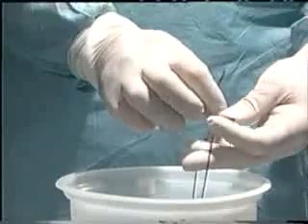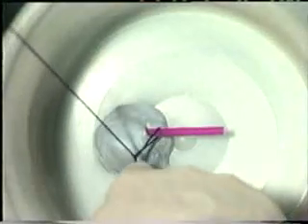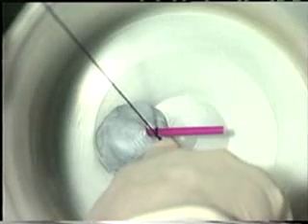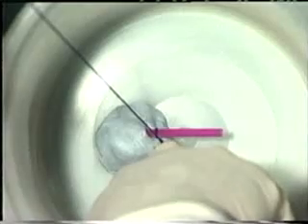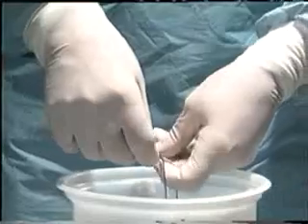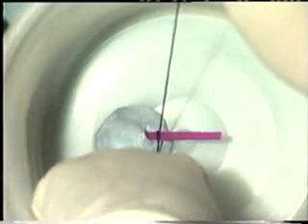Bring the suture material out of the pelvis, tie and snug that down using the index finger. Again, exert no tension on the vessel itself, but tie against counter pressure from the index finger. Then tie a further throw outside the body, snugging it down with the index finger and tightening it by counter traction against the finger.